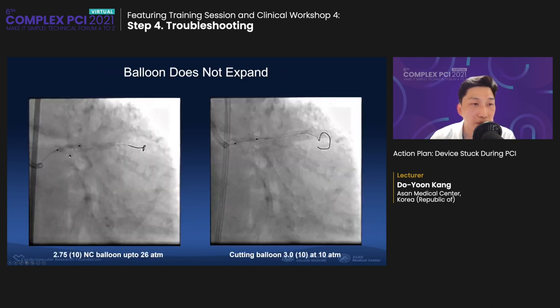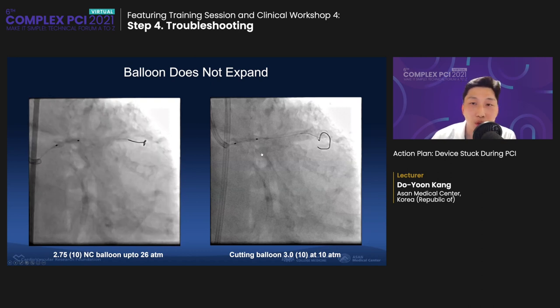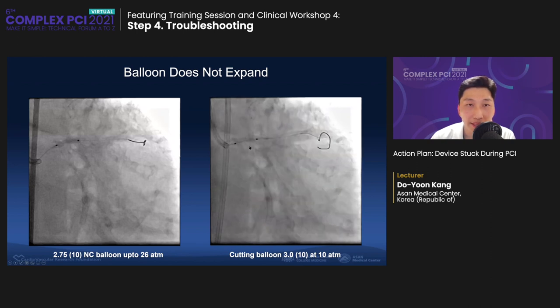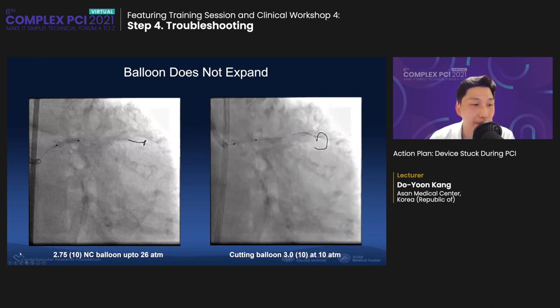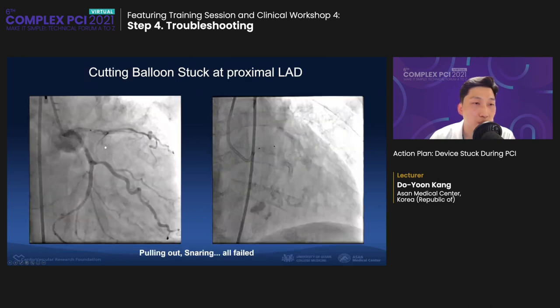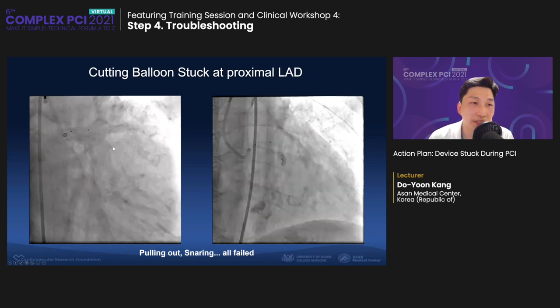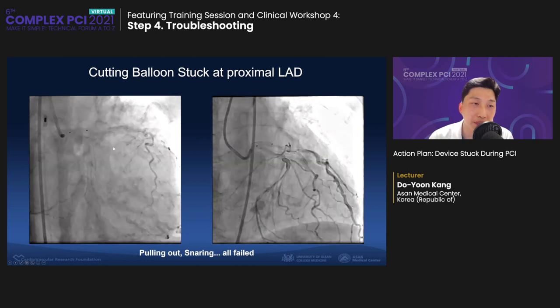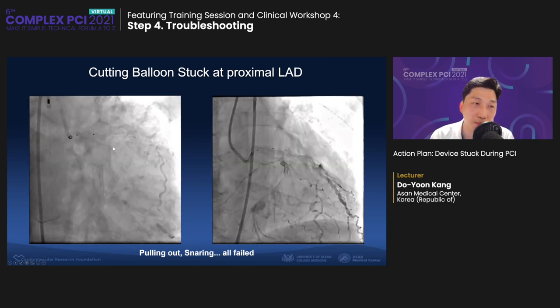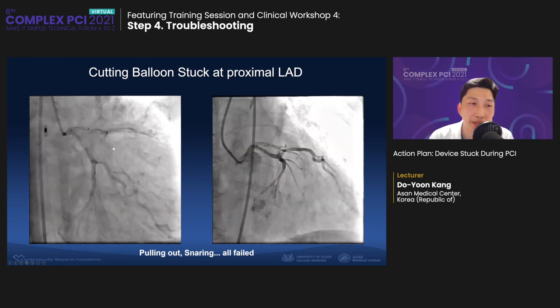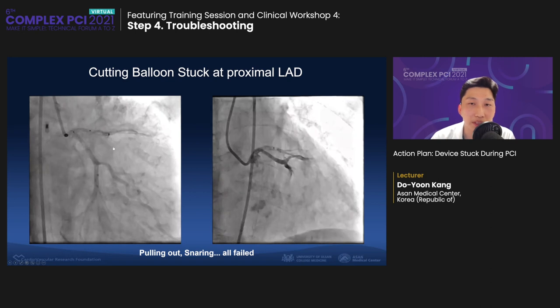Circumflex was treated with a 2.75 stent, and we checked IVUS for the proximal LAD — there was very severe calcification. We performed NC balloon and you can see the indentation; it does not open. So we used a 3.0 cutting balloon, and at 10 atm it was trapped. We tried wiring but it could not pass the region, and pullback did not work. Finally, the patient underwent CABG.